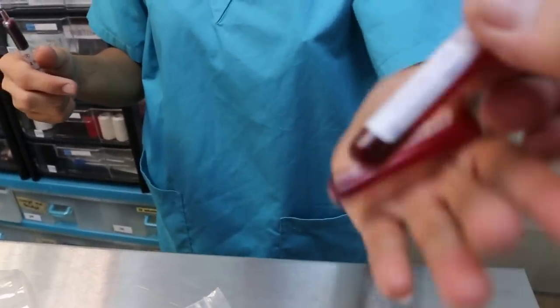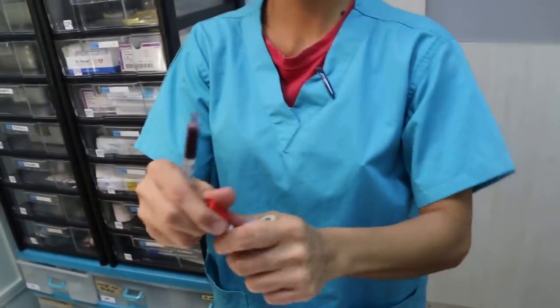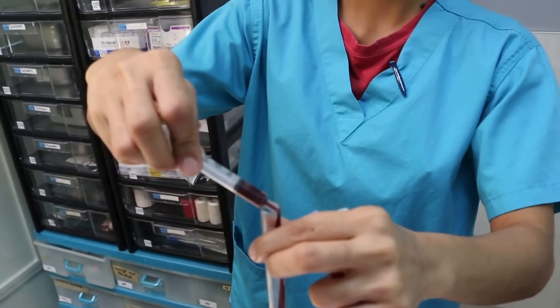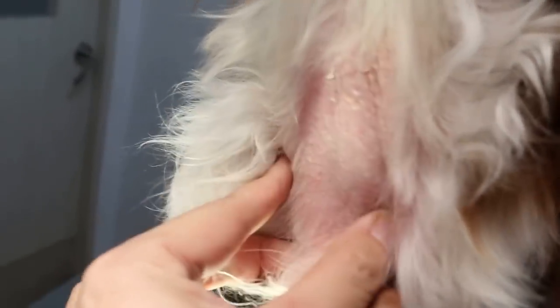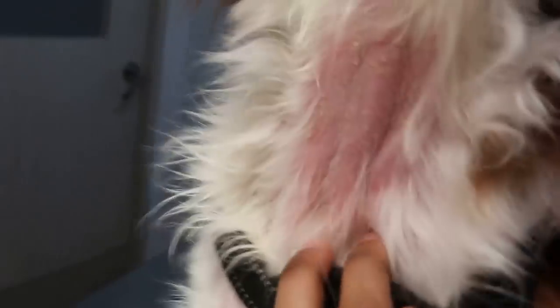The blood is collected from the jugular vein. The dog has a fever, so blood is being taken, also in preparation for the operation. Let me video this again. The blood was collected from the jugular vein. Press down here and you can see — an experienced nurse can see the vein.